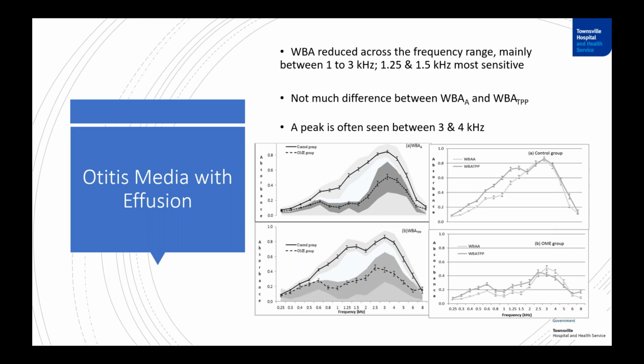So when you look at the middle ear effusion, you see that the absorbance is reduced, whether you do the ambient measurement or the pressurized one. So there's not much change between the 2 pressure conditions. It is reduced under both conditions, and it's significantly lower compared to the normal middle ear, whether it's ambient or in the pressurized condition.